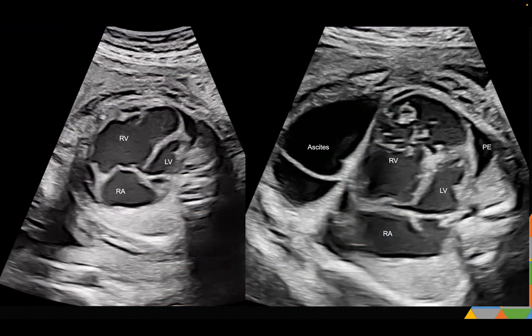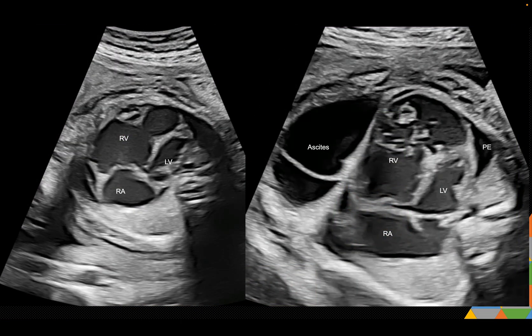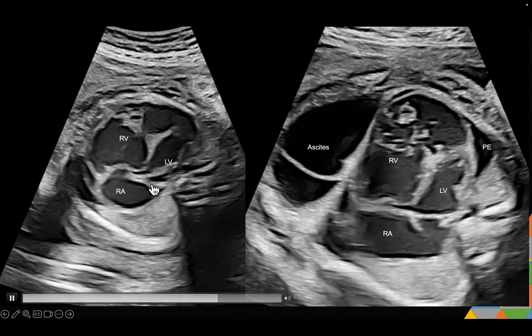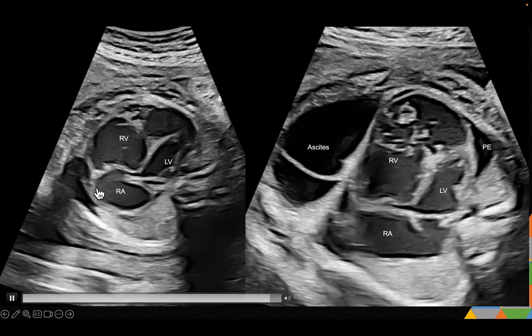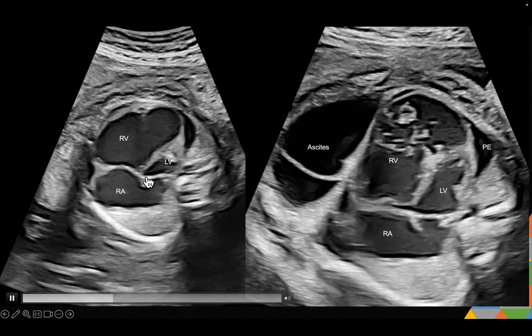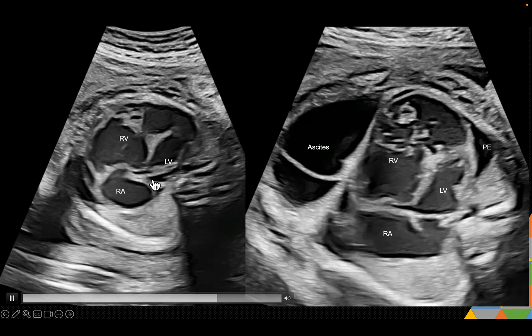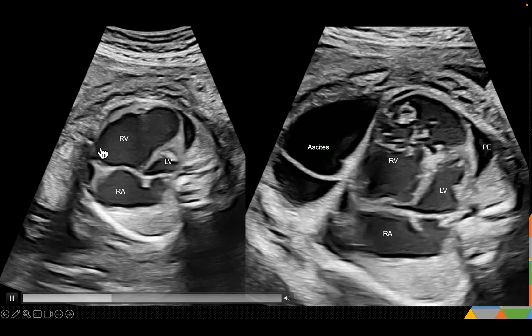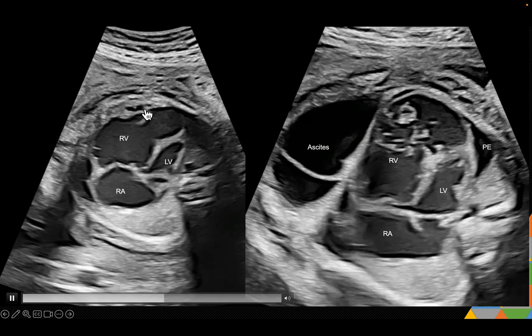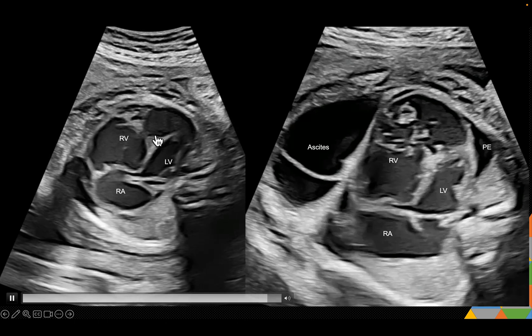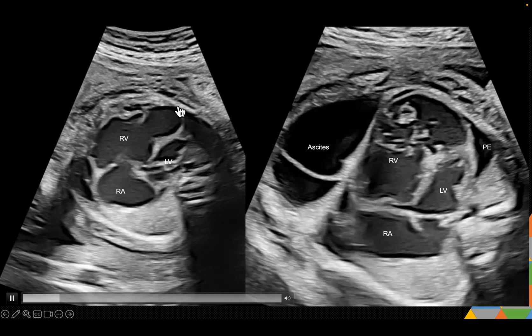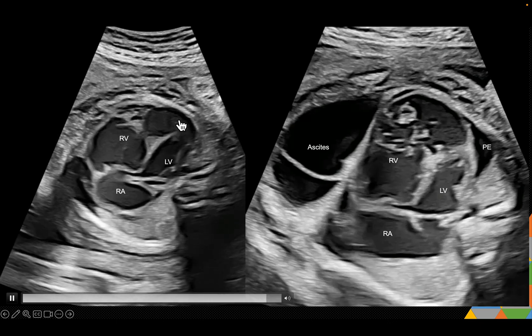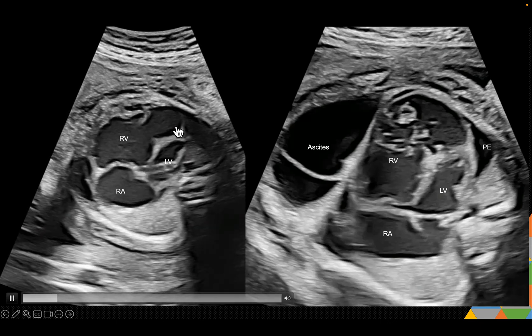Let's begin one by one. If you notice here, this is the right atrium, which is enlarged. This is the left ventricle, which is small. This is the right ventricle, which is dilated, and there is some aneurysmal dilatation here. You can also notice thinning of the myocardium.